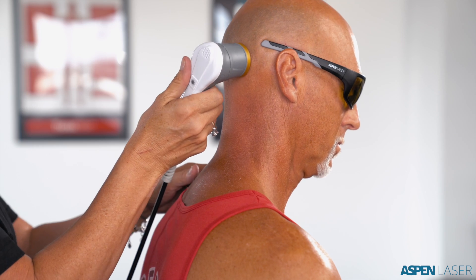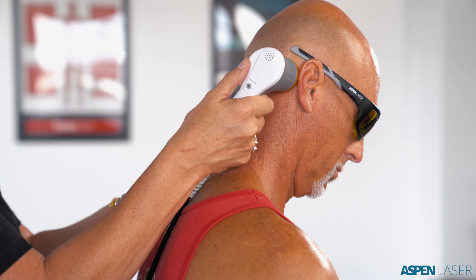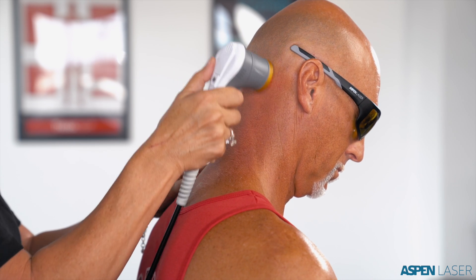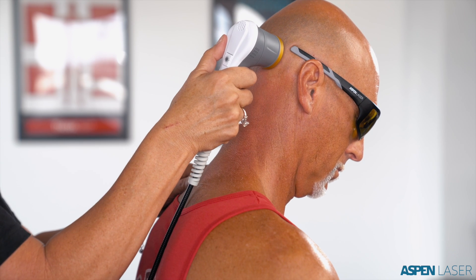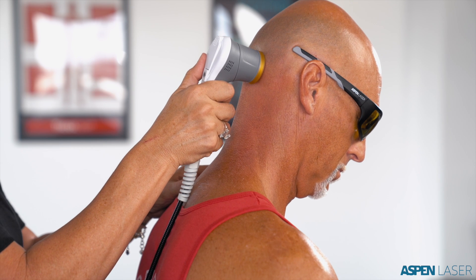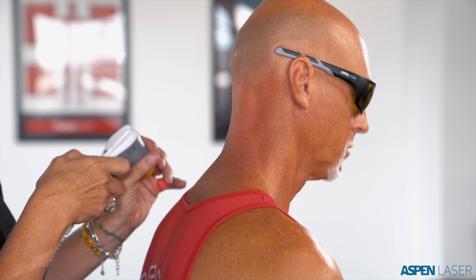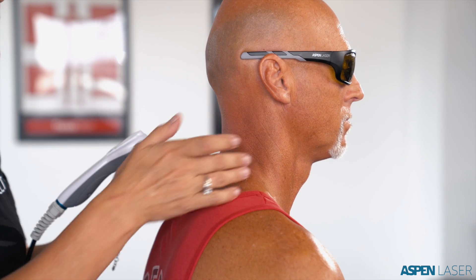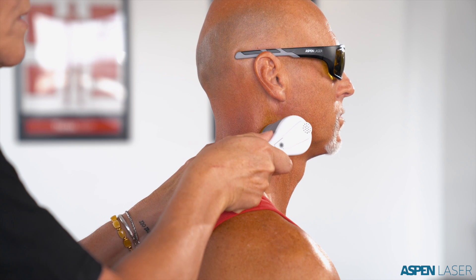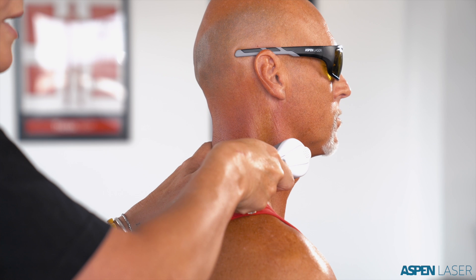Keeping the laser handpiece in the non-dominant hand until placed directly against the skin, I'm going to use a three-by-five treatment area because it's more short and wide — kind of like a playing card. My pace is very slow, using firm pressure, working left to right. When I reach the left side, I pick up the handpiece and start back on the right. I'll treat in two-and-a-half-minute increments and reassess. After two and a half minutes, the pain is zero — I'm finished. The next step is to treat the neck area he indicated was also uncomfortable, again in two-and-a-half-minute increments until pain is one or less at rest, with range of motion, and with palpation.